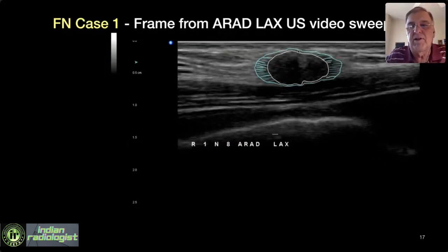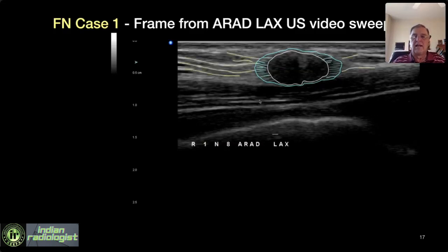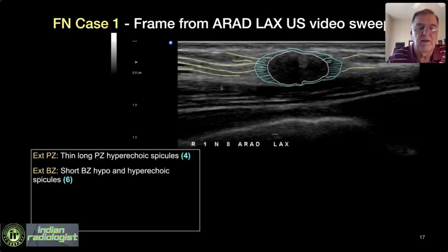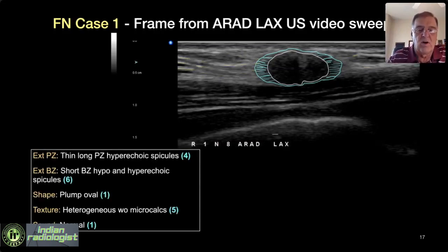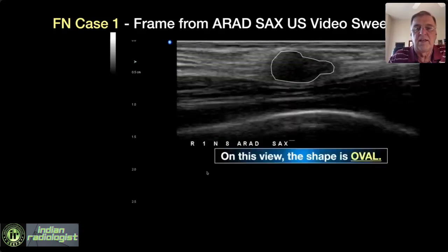This is showing a nice capsule on the front and back, but a thick, ill-defined echogenic rim on the ends. You can see alternating hyperechoic and hypoechoic spiculations as well as peripheral zone hyperechoic spiculations. In my scoring system, these all score pretty high. Even if you call it plump oval, there are other features that should prevent the false negative.